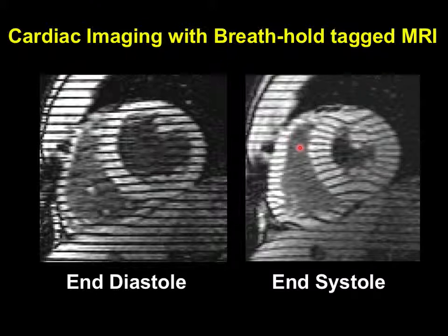So really you need a sequence of heartbeats that are the same R to R in order to assume that at least the pose of the heart is the same for each one. We can withstand a certain amount of variability, 10% or so. Because when you trigger from the EKG and you measure dynamics to end systole, that time is fairly consistent. Even if my R to R changes by 10%, the time for the heart to contract is usually about the same with that small change in the R to R. So those images remain coherent, the ones that are gated to the QRS.